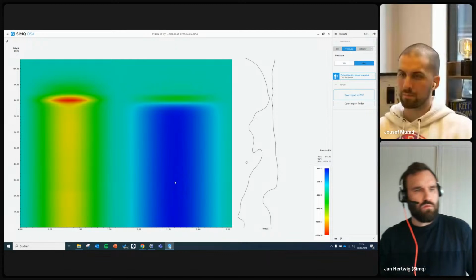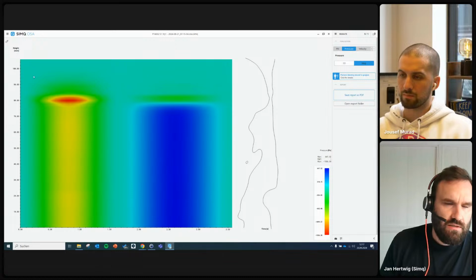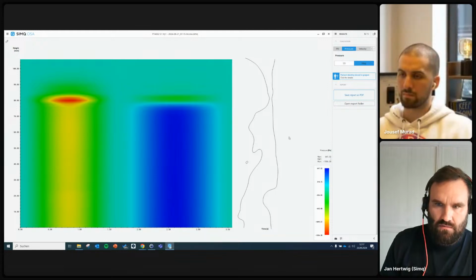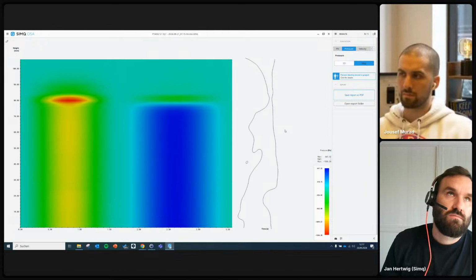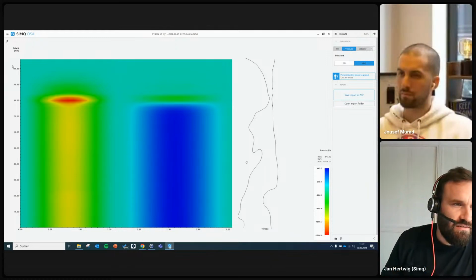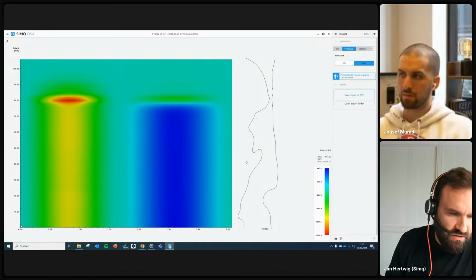So if you don't want to take a look at the 3D images, you can show it in these cut sections. It's called the sagittal plane. So like in one rectangular or parallel direction, it's hard to say. So like once in that direction. I hope you see my face. And then you see the results dependent on the position and the time. So that's a bit complex to see, but it's during the breathing cycle.